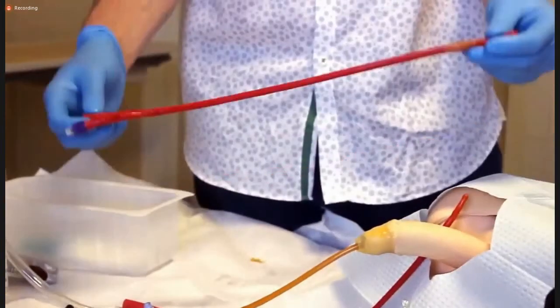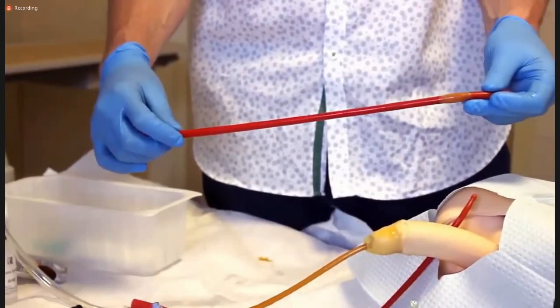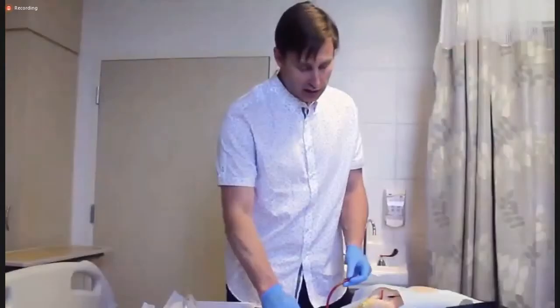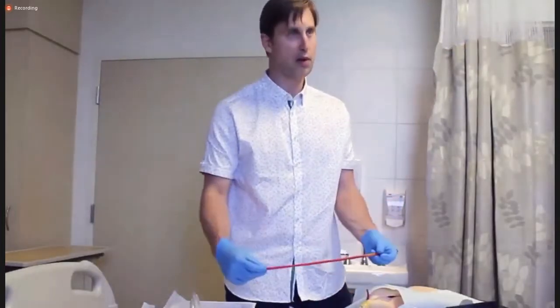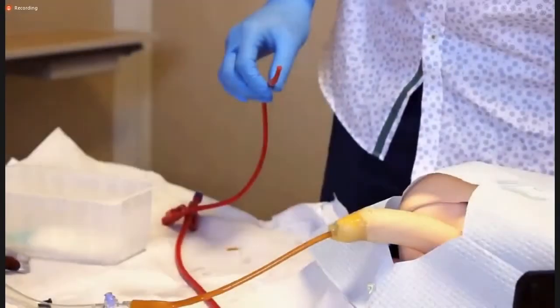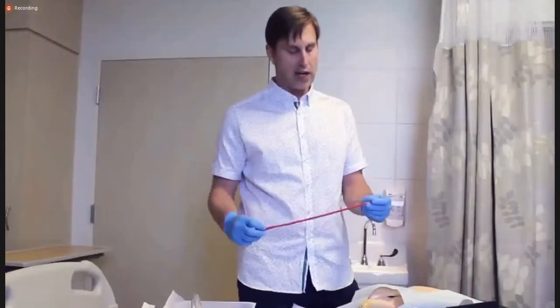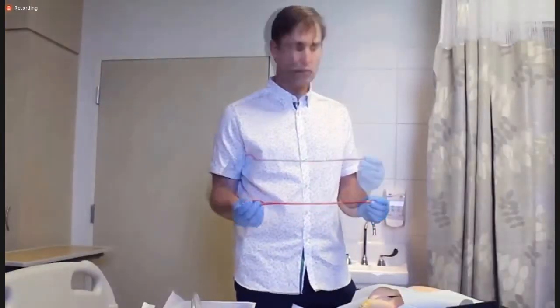So these are very similar to any other catheter except for the third drainage port, and they're slightly bigger in size. So if you can put a regular catheter in, you can also put a coude catheter in. You can also put a three-way catheter in. Now, the coude tip catheter is very useful, as I said, for men with prostate enlargement, where you have some difficulties placing the catheter because of the size of the prostate.